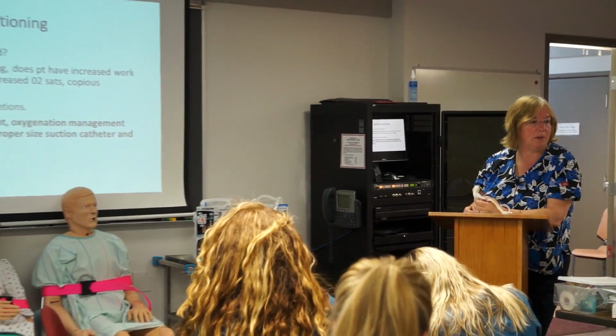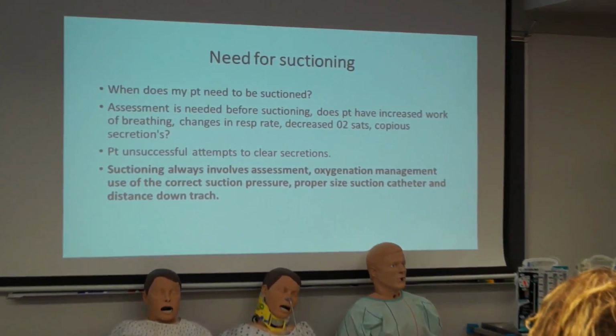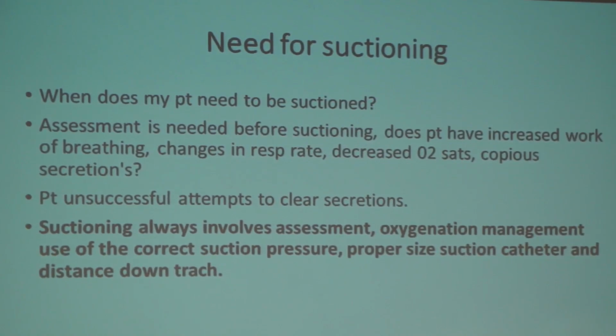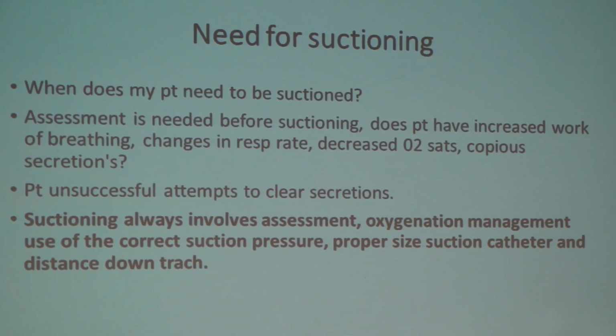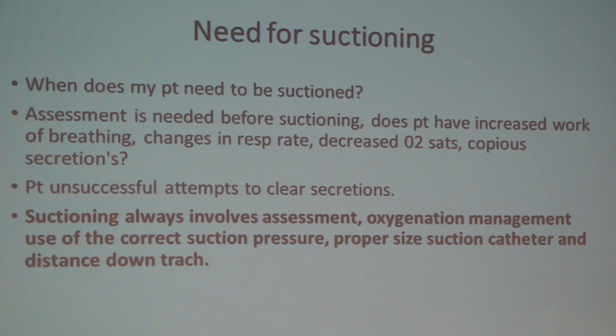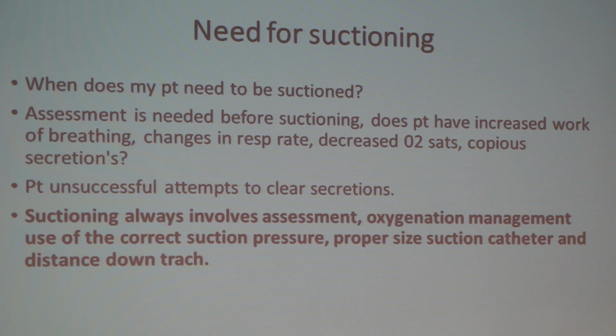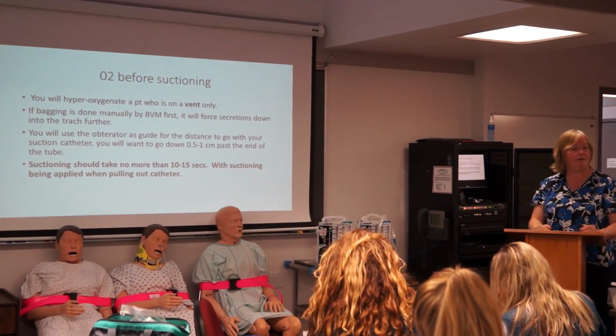Now, you guys remember that when we talk about suctioning, we always want to only suction on the way out. All right, we don't want to apply suction when we're going in because we're sucking out that patient's oxygen. When we are applying suction, we're taking out that oxygen, so we want to only do it for the shortest amount of time. It's not something that we put in as we're going in, and as we're going out, the patient's saturations will significantly drop.